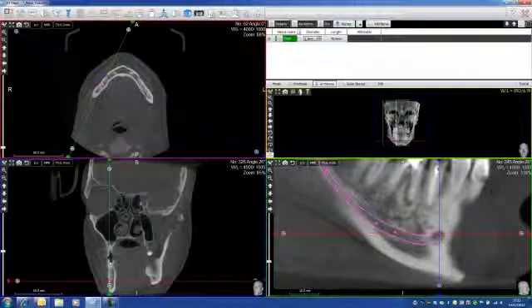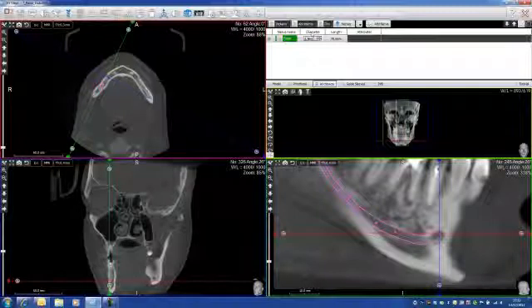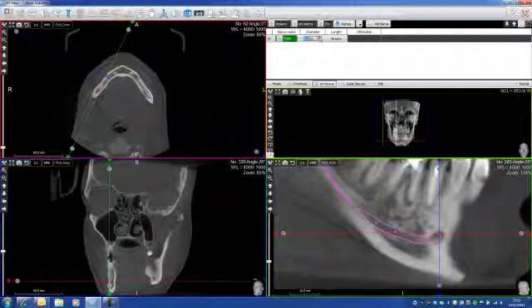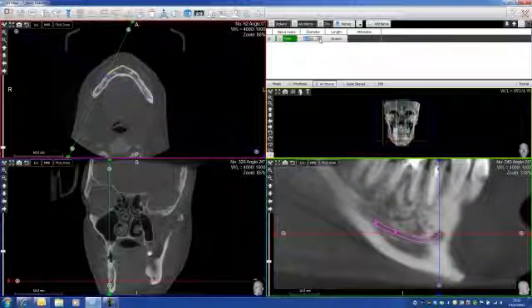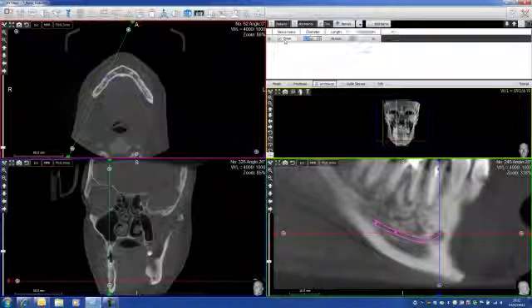I can change the diameter. As you can see here, I can increase or decrease. Let's put one and a half — it's pretty good. When I'm done, I click Finish. There we go.